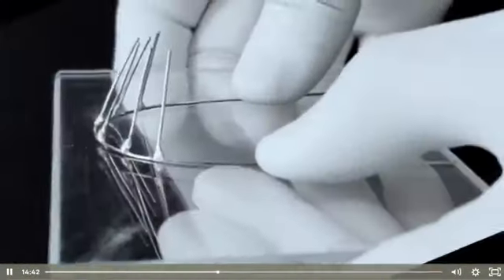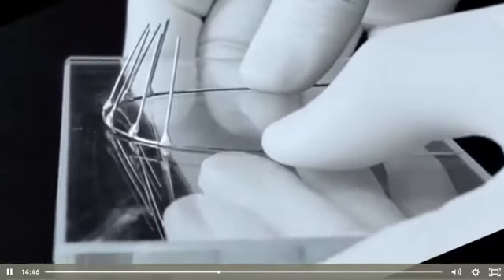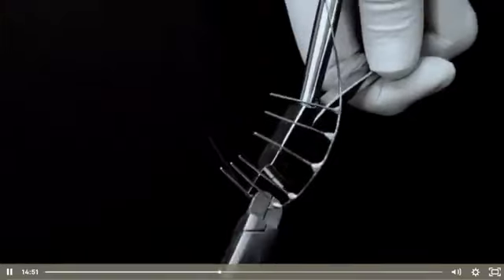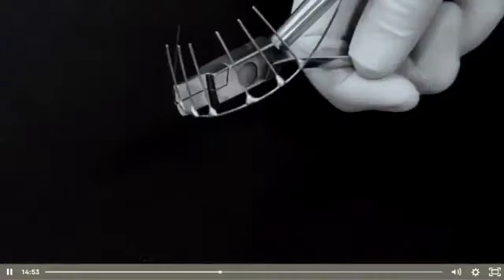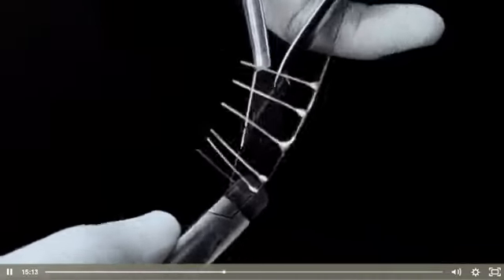But when I do that, the canines are in this anterior segment. So the canines are also receiving the negative torque. And I don't want that. How do I know this? Look at the strip. The strip of the canines, the tip of the last strip, let's say. This is the strip of the canine. They are going towards the center, you see? So I don't want that to happen, and I'm now neutralizing the torque.